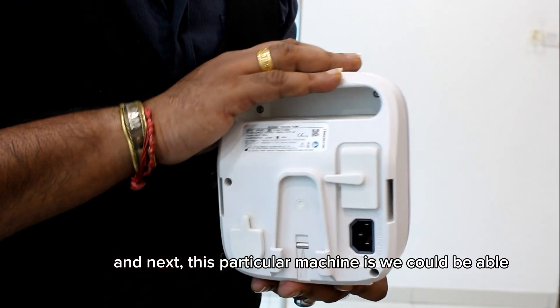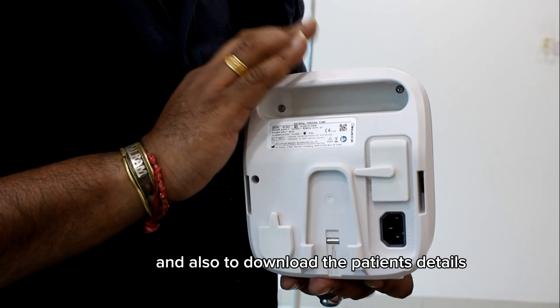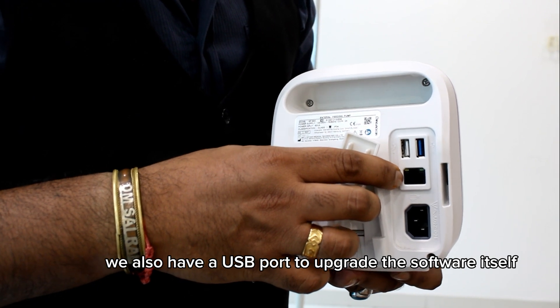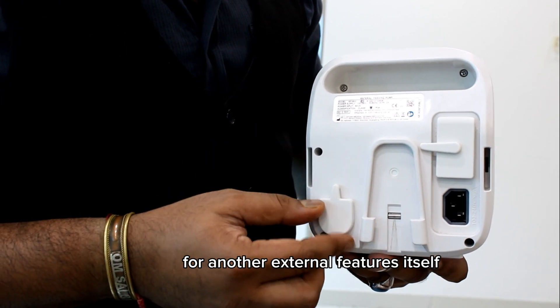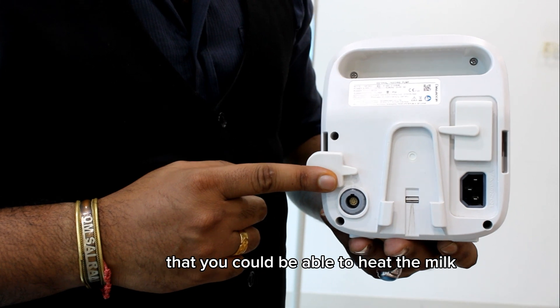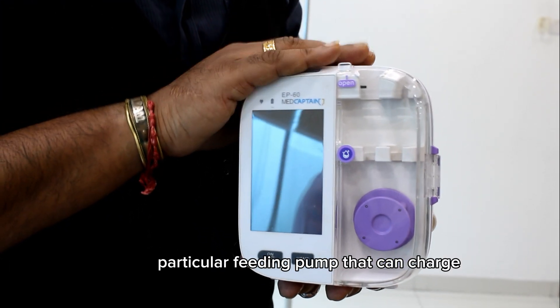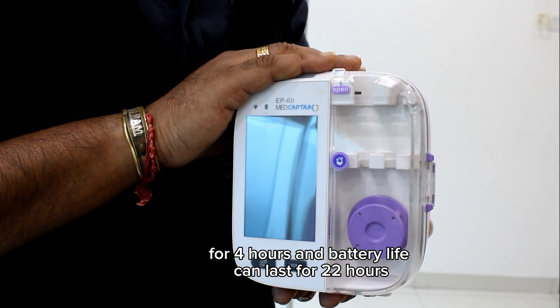This machine is able to upgrade software and download patient details via the RJ45 port. We also have a USB port to upgrade the software. For an additional feature, we have a heater that can heat the formula when it is delivered to the patient. The battery charges in 4 hours and the battery life lasts for 22 hours.